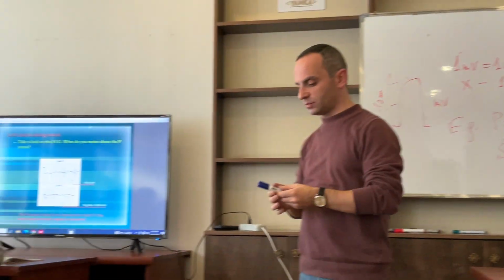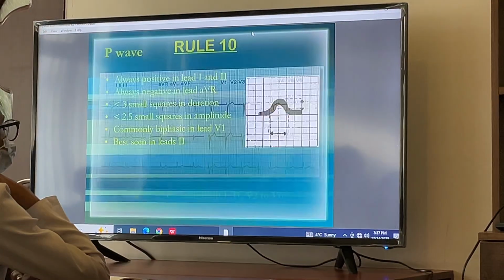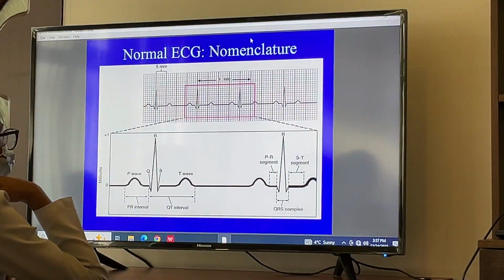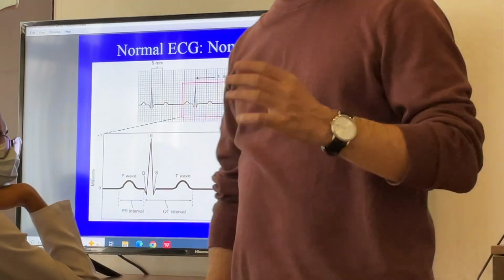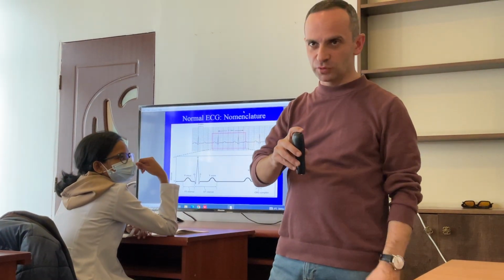So that is vertical size. But we also have horizontal size. Horizontal size depends upon paper speed, with some exact speeds at which the paper is passing. Imagine that somebody with a pencil in hand is sitting inside the machine and is drawing there.